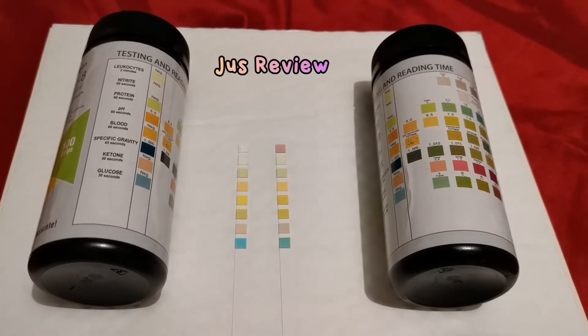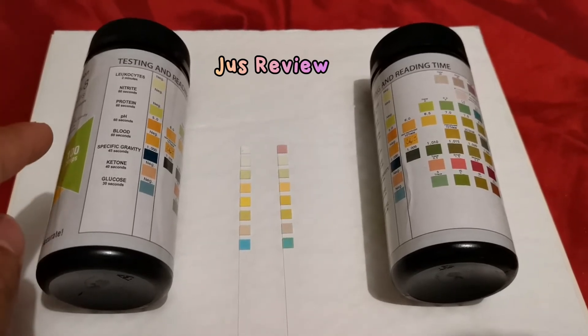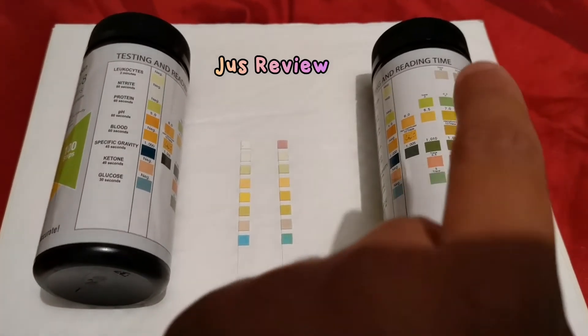In this video I'm going to show you the difference between new test strips and test strips that can't be used for a fair test. The one on the left has new urine test strips and the one on the right are the ones that cannot be used.